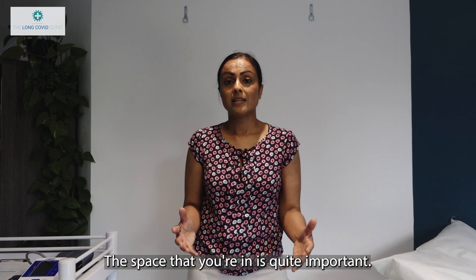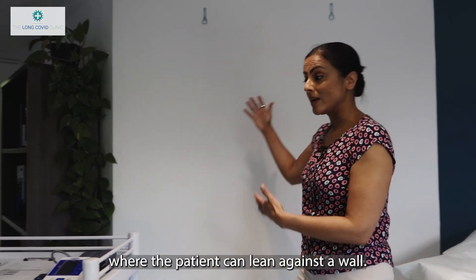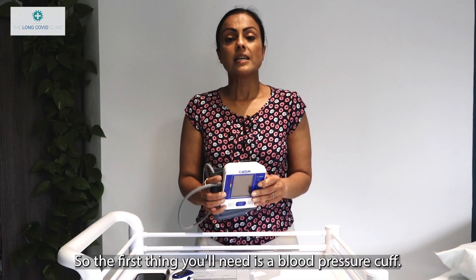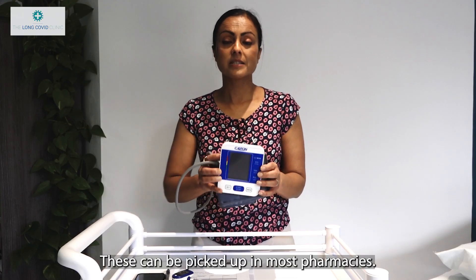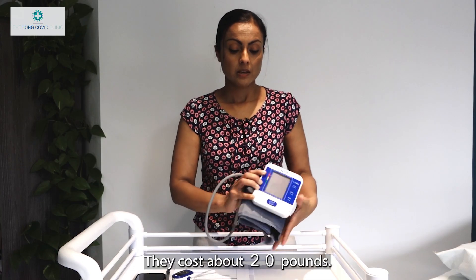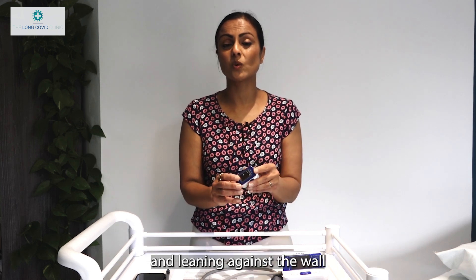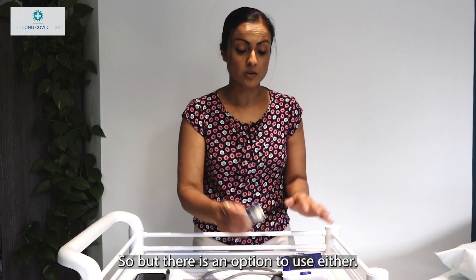The space you're in is quite important. You will need somewhere to lie down, like a couch or a bed, and a space where the patient can lean against a wall. The first piece of equipment you'll need is a blood pressure cuff — ideally one that can also measure heart rate. These can be picked up in most pharmacies or bought online for about £20. If you haven't got a cuff that measures heart rate, you can use a pulse oximeter, but be mindful that when standing and leaning, these can become a little temperamental.